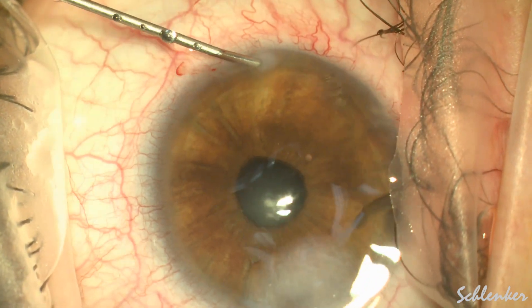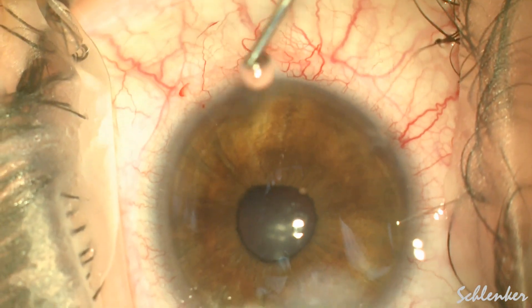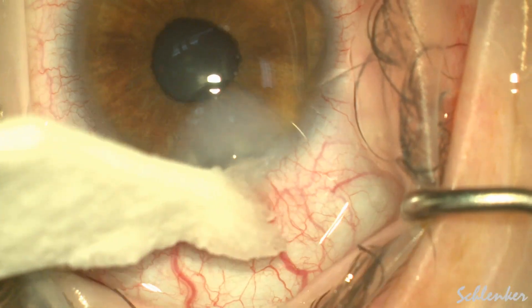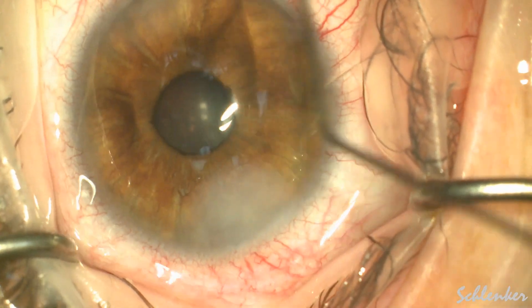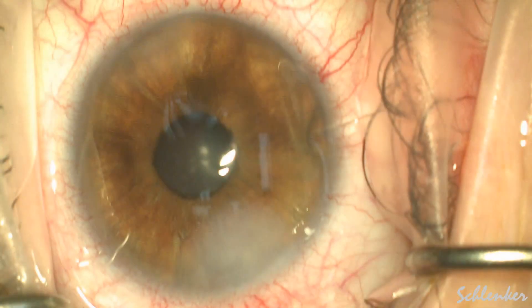Here we are just hydrating our wounds and inflating the eye to about 35. I left at least 50% cohesive viscoelastic in at the end of the case. And on post-op day 1, her pressure was 5.